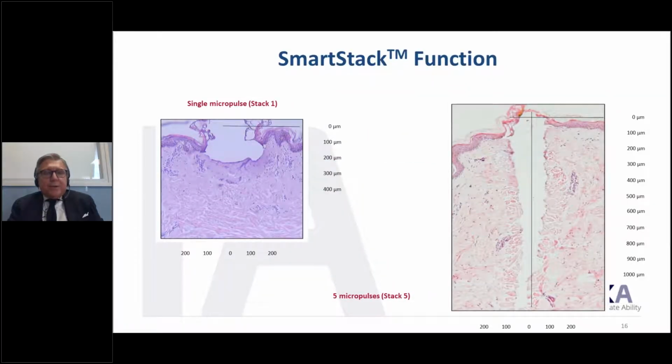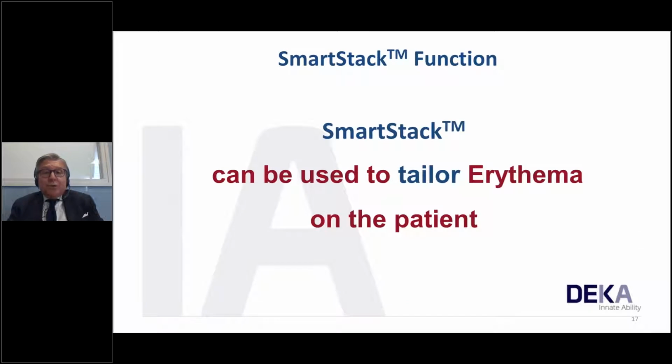This is the comparison between stack 1 and stack 5. You see the great capability to go into the depth. So smart stack can be used to tailor erythema on the patient.